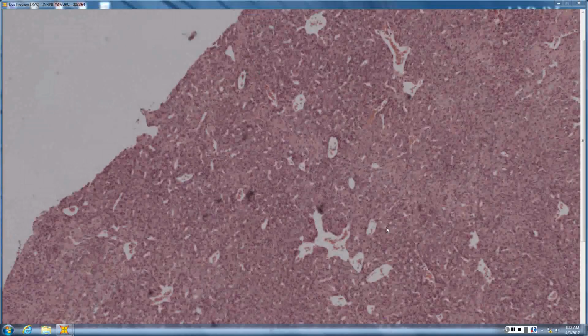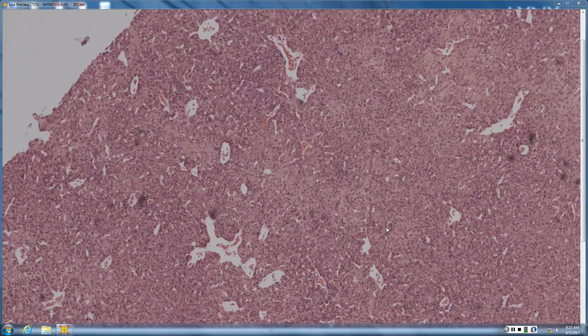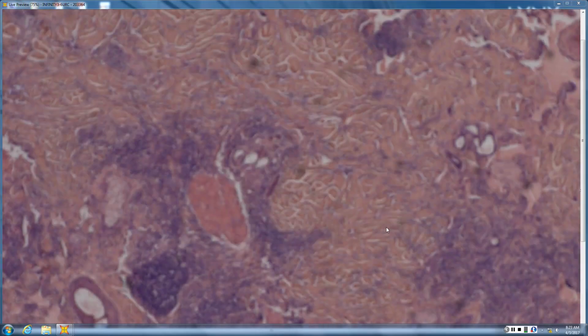Very cellular with staghorn-like structures. So what would they have called a cellular thing with staghorn-like structures back in the old days? Hemangiopericytoma. And then the more spindly ones are solitary fibrous tumor. This one's not spindly at all. And this is one of the ones that the soft tissue guys even now still call hemangiopericytoma. They're not true. Hemangiopericytomas are not common, but they still occur.